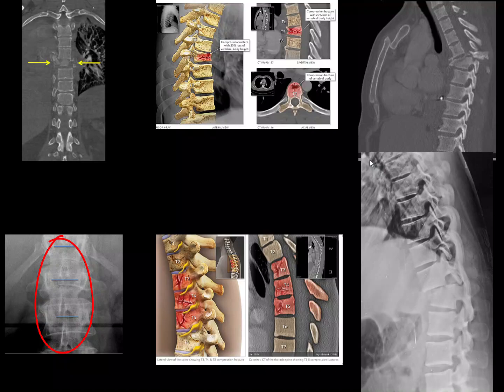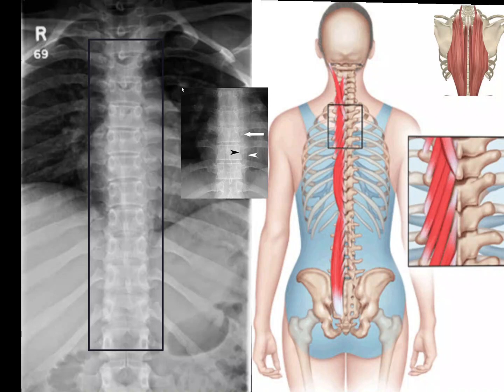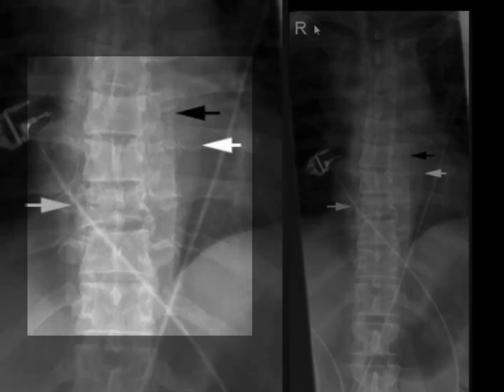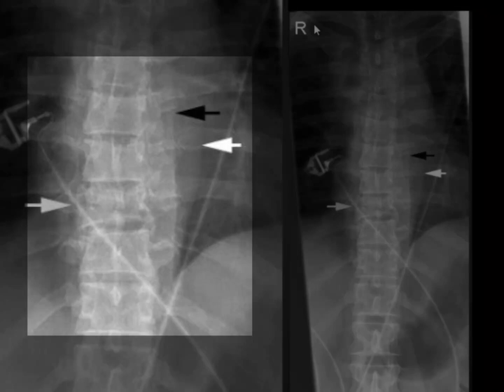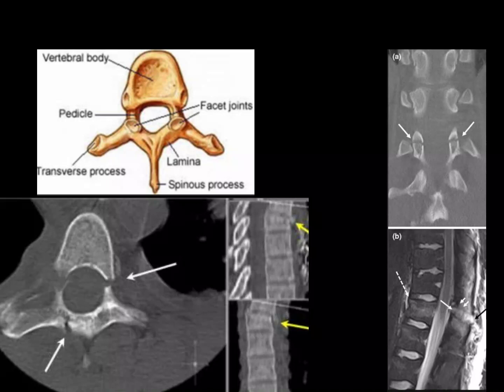Let's review the thoracic spine once again and take a look at that paraspinal stripe. It may be difficult to see a subtle fracture of the thoracic spine, but by looking at the paraspinal stripe, knowing that when there is a fracture there is swelling, the displacement of the paraspinal stripe gives you a clue that there might be a fracture. Another clue for fracture in the thoracic spine is to take a look at the pedicles. CT clearly shows a fractured pedicle in both the AP and lateral views of the spine.